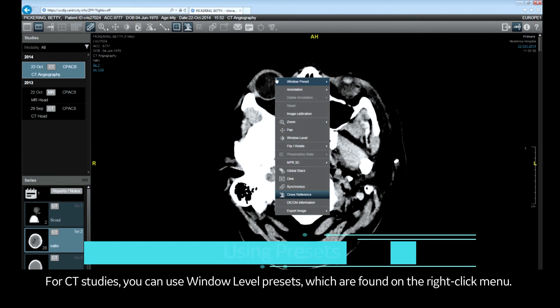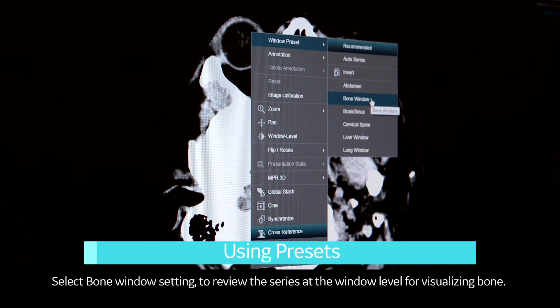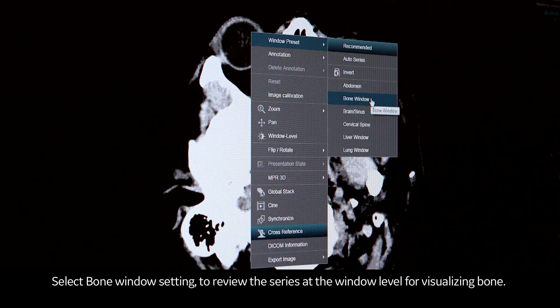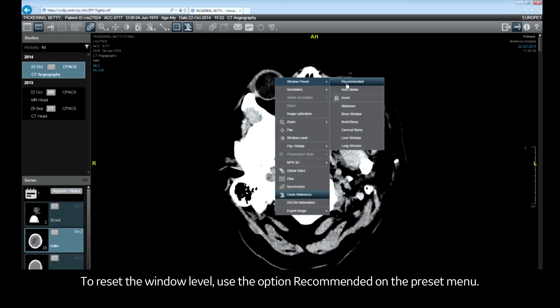For CT studies, you can use window level presets which are found on the right-click menu. Select the bone window setting to review the series at the window level for visualizing bone. To reset the window level, use the option recommended on the preset menu.